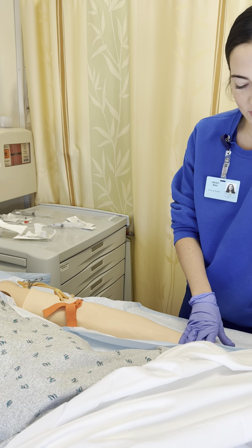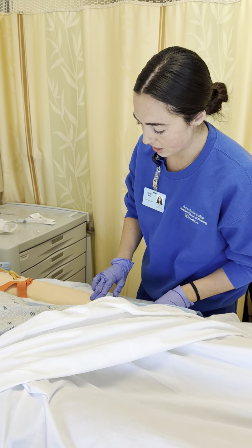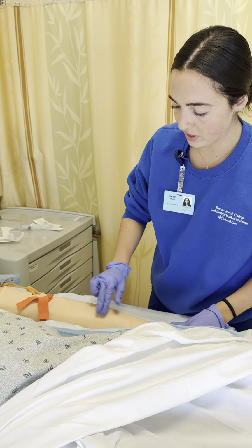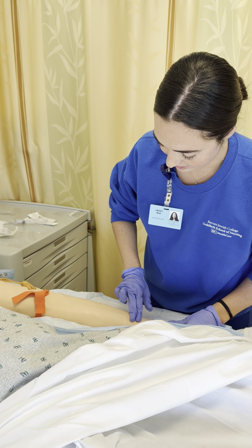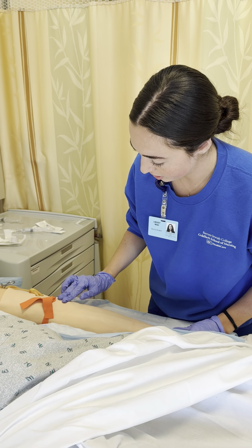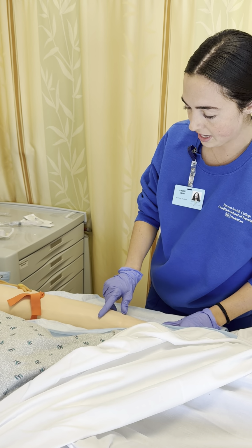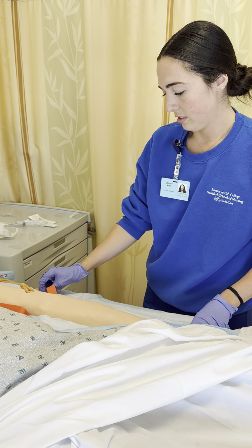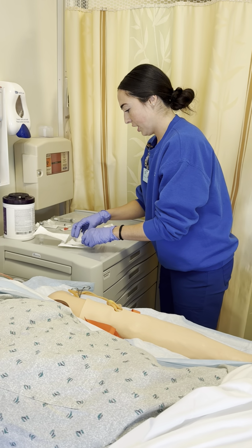Alright, I may have Ivy pump her hands a few times while I look for a good vein. I'm looking for something that has good bounce to it and is visible. I don't want one that's going to roll, so I'm going to try to prevent that. It looks like I found a good one right here, and I'm going to pop that tourniquet and let it relax just for a little bit while I get prepared. So, all right.